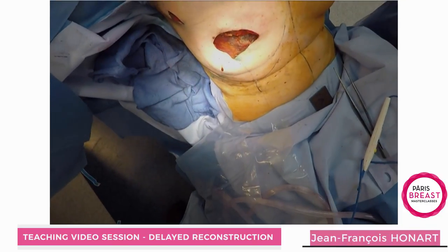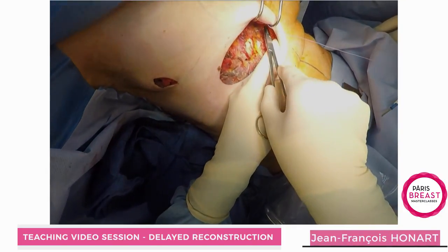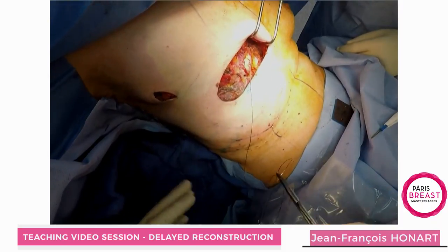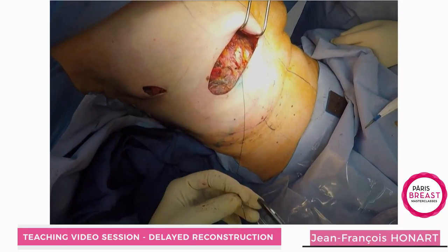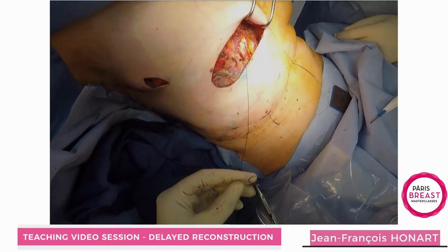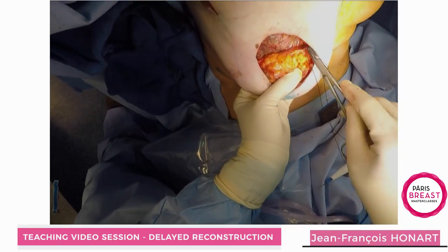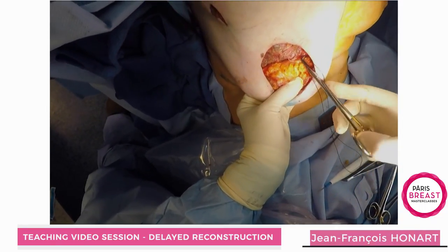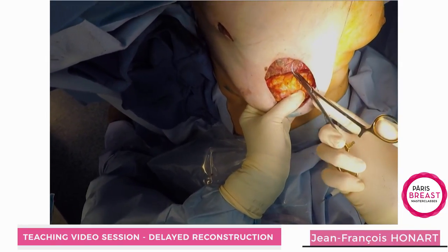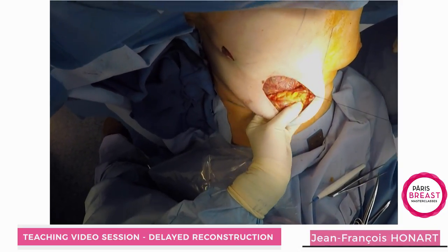You will fix the inferior border of the incision to the chest wall. We are going to fix it using Vicryl. At the inner part it is very easy — you fix into the cartilage. You do the running suture, taking the inferior part of the fascia.